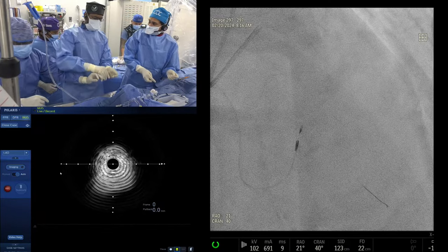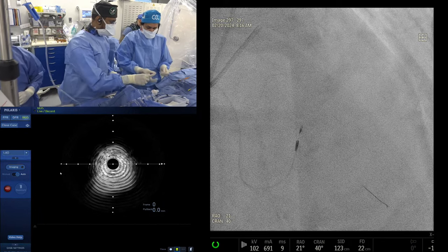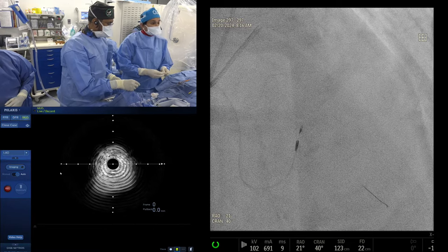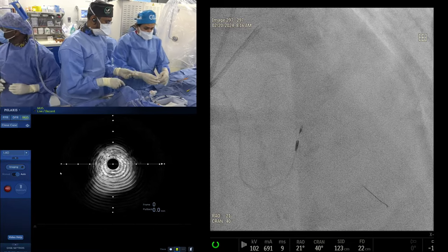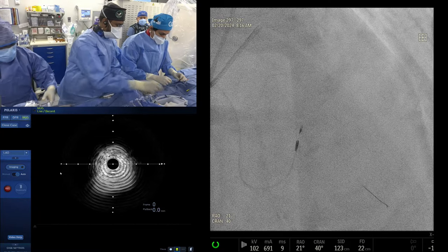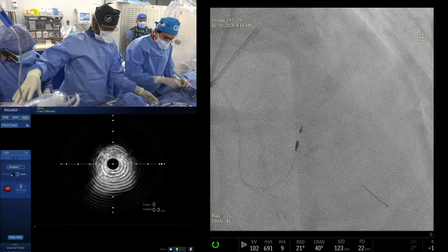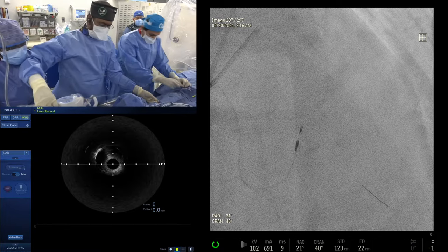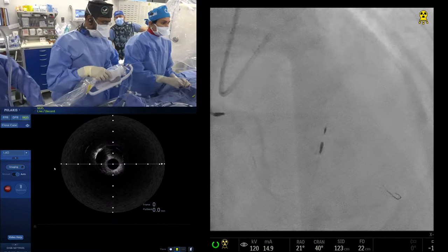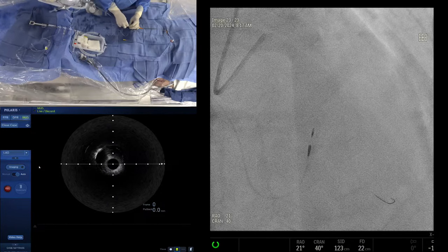Prediction, mild calcium. Okay, so mild calcium means less than 180 degree arc, and some people define less than 5 millimeter and less than 180 degree arc, and 270 and 10 millimeter is moderate. More than 270 and more than 10 millimeter length is severe. Although thickness cannot be diagnosed on IVUS, while with OCT you can make the diagnosis of the thickness of the calcium also, which comes into the equation at 0.5 millimeter and 1 millimeter. Okay, so this is where we are now, ready to do the IVUS of the segment.